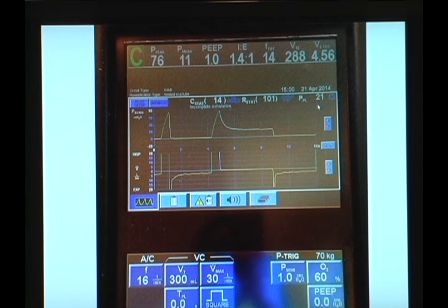So this patient, I would argue, is not at risk for ventilator-induced lung injury with this plateau pressure. The question that came along with the text is, is this the highest airways resistance you ever saw? And my text response was, yes.